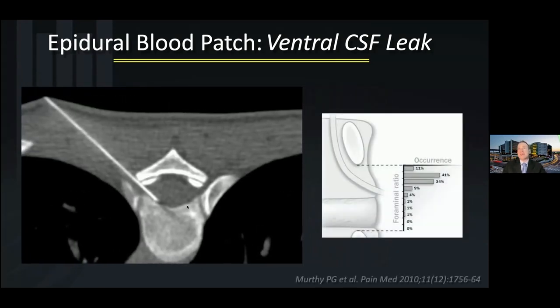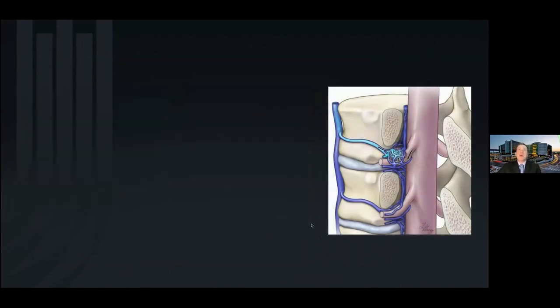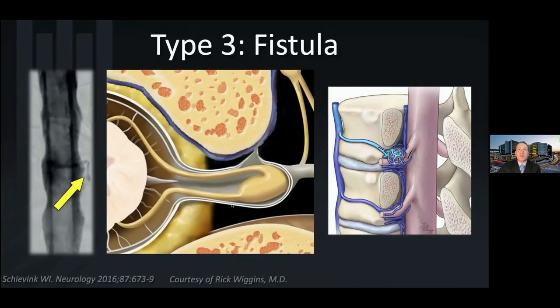Since you're driving past arteries that are in the foramen, it is important to note where those are located. In particular, some of those arteries are actually radiculomedullary arteries and provide blood supply to the cord, and so you can end up with cord injury. So it's important to note that most of the arteries are located in the superior and anterior aspect of the nerve foramen. So whenever possible in placing these needles, we try and come in along the inferior aspect of the foramen.